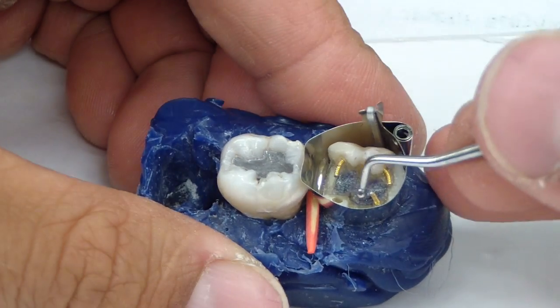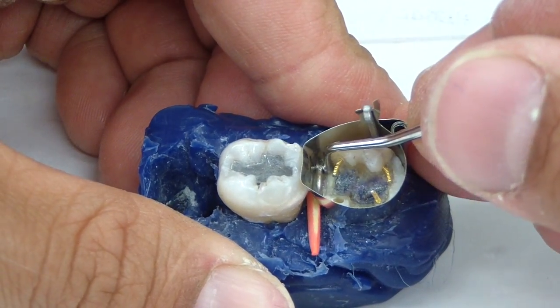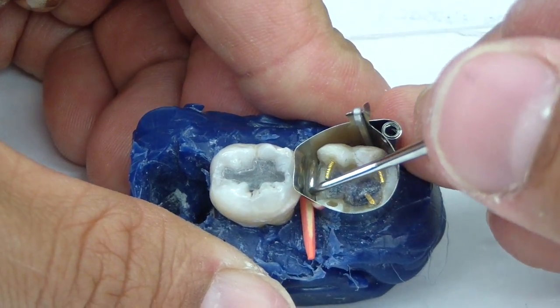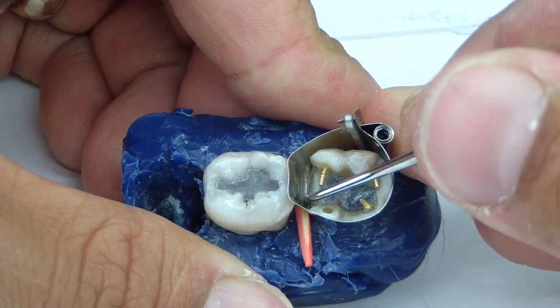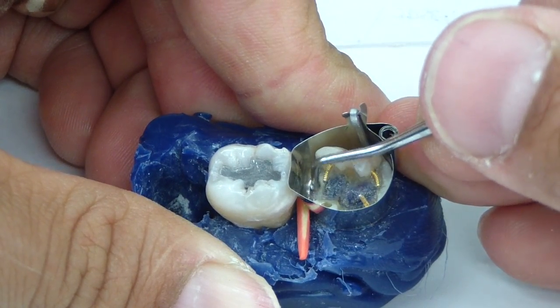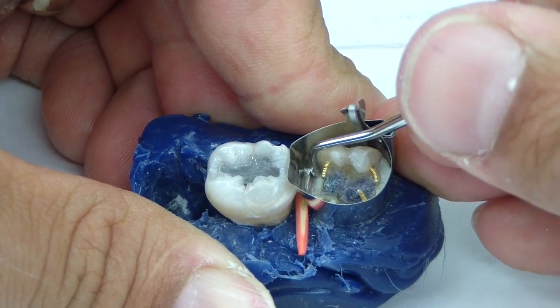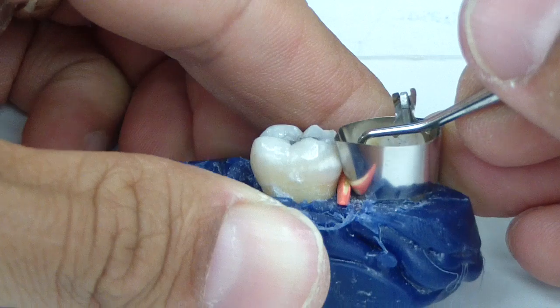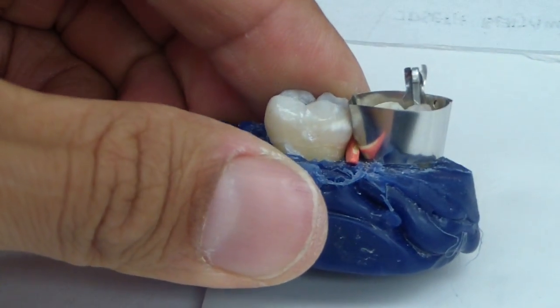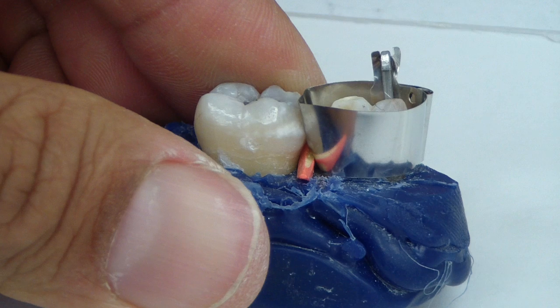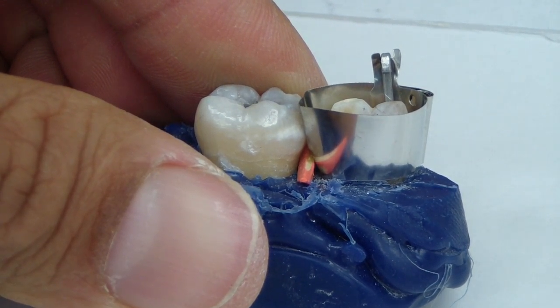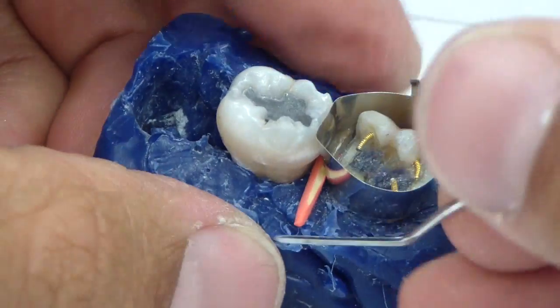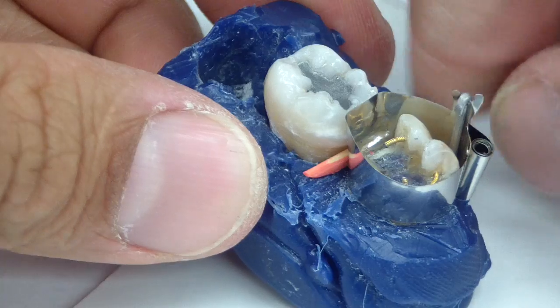But one of the problems I've found, same for every matrix system, especially if they're stainless steel, is that you go to burnish it, and this is a complex amalgam. Yes, I know there's lots of pins, it's for a demonstration for something else, but this works well for this because you see how now I'm starting to see that wedge, and Dr. Queso talked about adjusting our wedges so we don't get that little dent because I've been burnishing my matrix to the adjacent tooth. Now what happens is, you can see, I'm getting an odd contour to my matrix band.